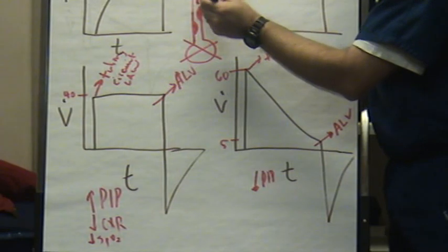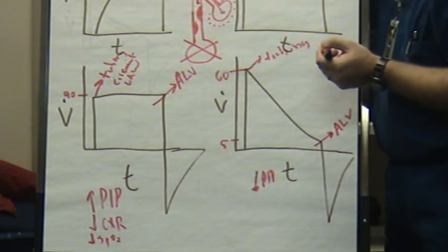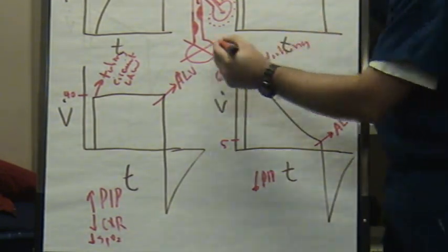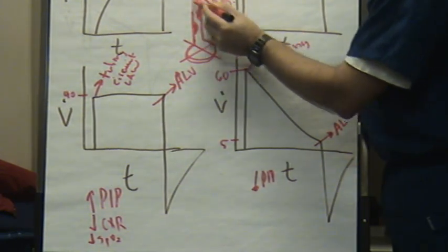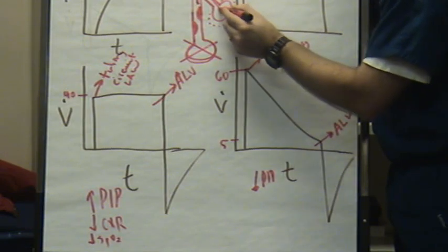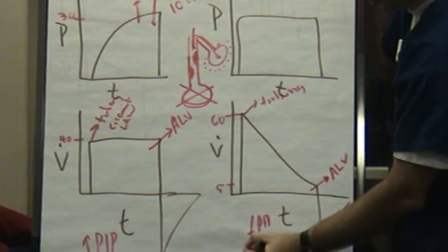And you just told me a slower flow is going to have a better shot at getting through there. So is this atelectasis going to resolve possibly? It should. If we have a good PEEP and other settings, then it should. So we might recruit that back. And if we do that, pressure then can equilibrate. Does that make sense? If this is high pressure on this side, it's going to kind of equilibrate and even out so that you have a better x-ray at that point.